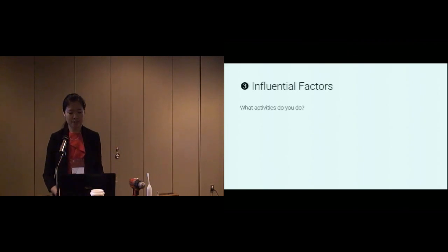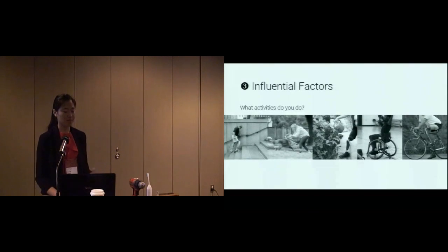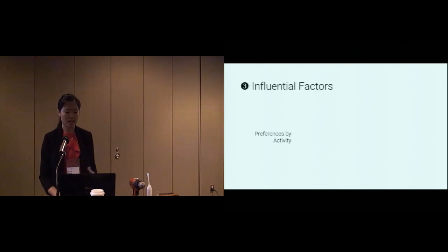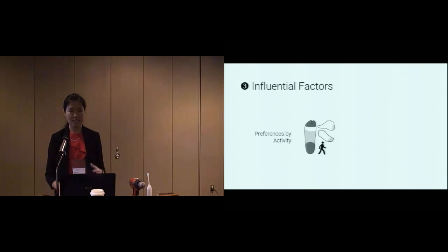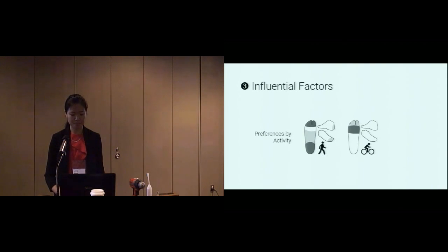We then asked what kind of activities they do. And actually, our participants did a wide range of activities. So things such as walking up and down the stairs, but also, for example, wheelchair basketball and bike riding. And again, if we try to assess their sensing responses based off of their activities, we can find some very interesting sensing maps. So for example, someone who would walk would like to have sensing on all over their foot. And this matches the fact that they want to avoid accidentally tripping on objects, for example.